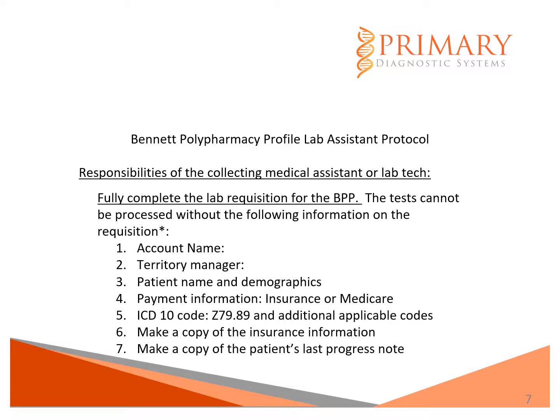Please note that it is the responsibility of the medical assistant or lab tech to fully complete the lab requisition for each BPP. These tests cannot be processed without the following information on the requisition. 7 items: the account name, territory manager, patient name and patient demographics, the payment information, ICD-10 code, and additional applicable codes. Please also make a copy of the insurance information and make a copy of the patient's last progress note.